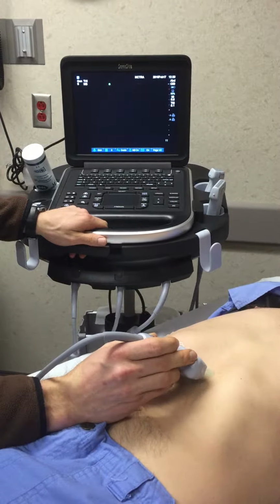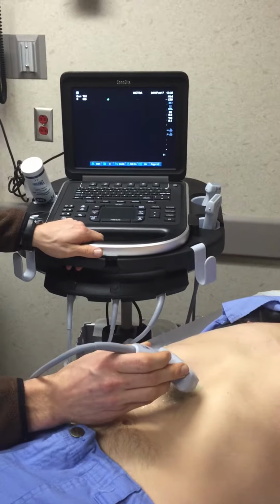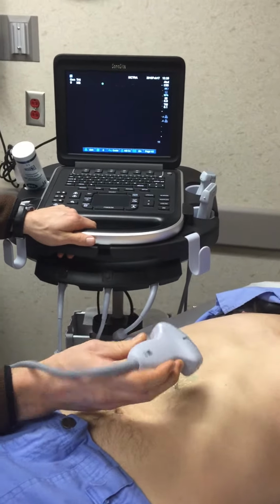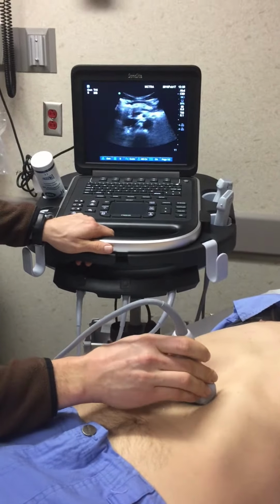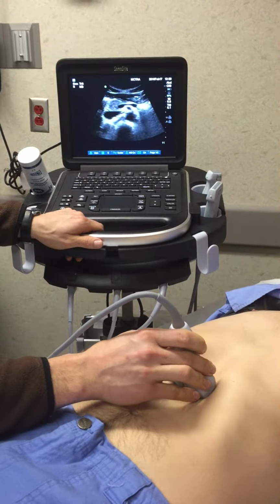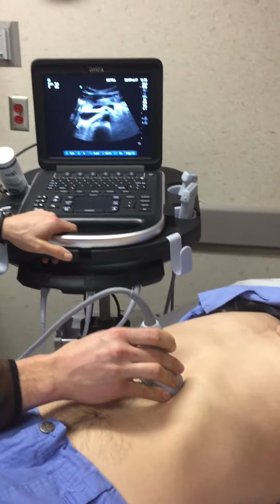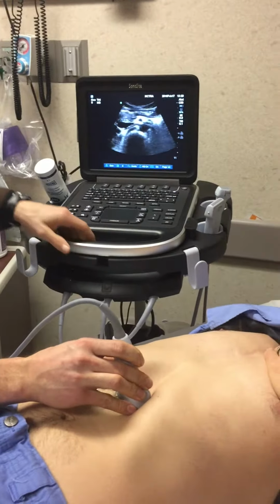Today we're going to talk about image acquisition for the abdominal aorta. Initially you want to start in a transverse approach, about 90 degrees to the abdominal wall surface, with a little bit of pressure. Typically you would start proximal, however you can start distal or in the middle. So you start proximal and you hold a little bit of pressure.